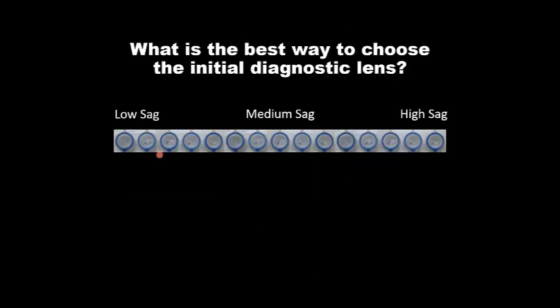We'll talk a little bit more about adjusting the limbus, but have a look where the lens may be thinning, and if you're at all concerned that modifications may be necessary, just have the patient look in the opposite direction to that thinning. If you see it clear, chances are modifications are unnecessary. Now, how do we choose the first lens?